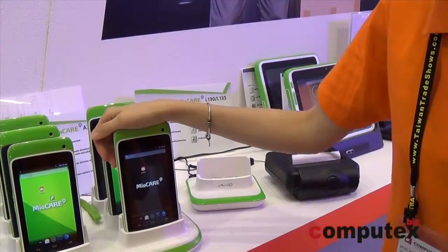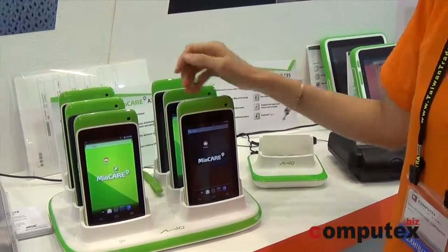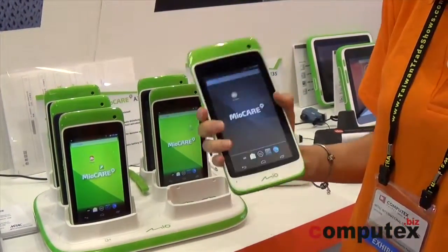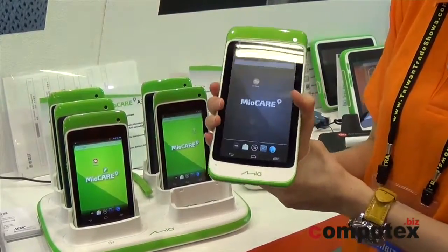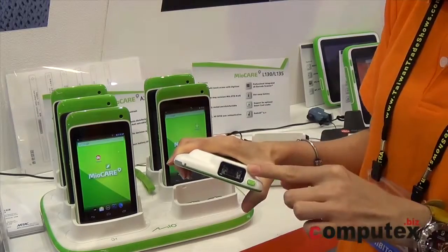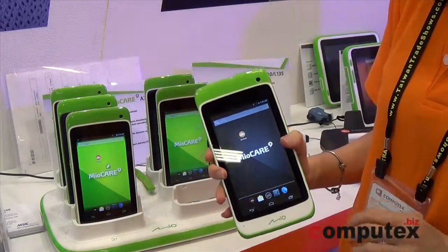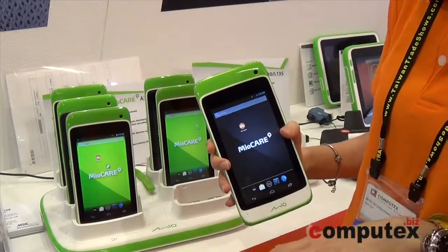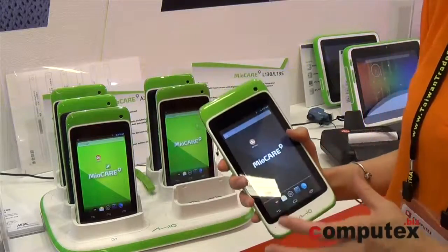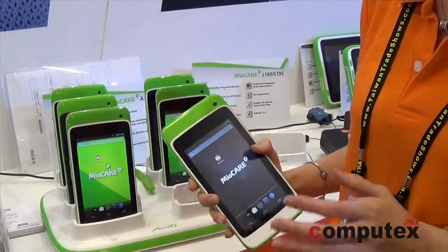This tablet is designed for healthcare, especially nursing. We designed this for one handheld size — you can see this is my one palm to hold this tablet. We have the barcode reader design embedded. The IP54 rating includes a one-meter drop protection system. This is an Android platform, so you can design every different application that you want.